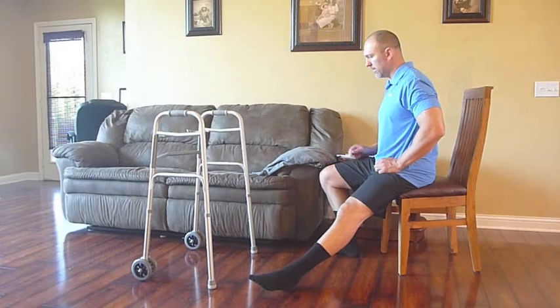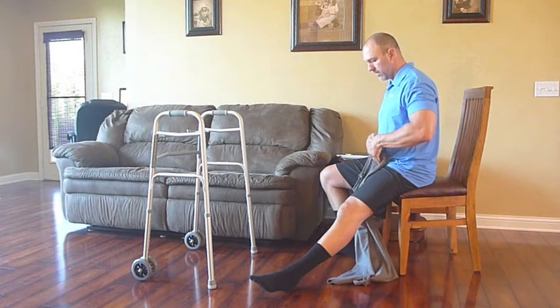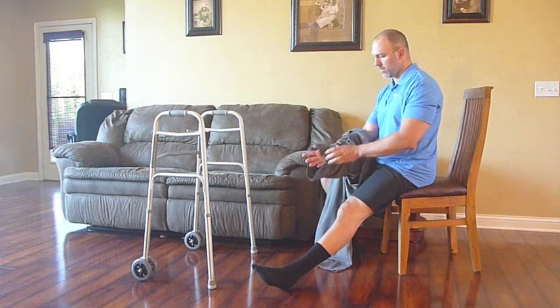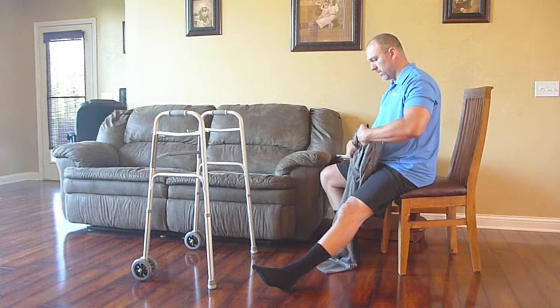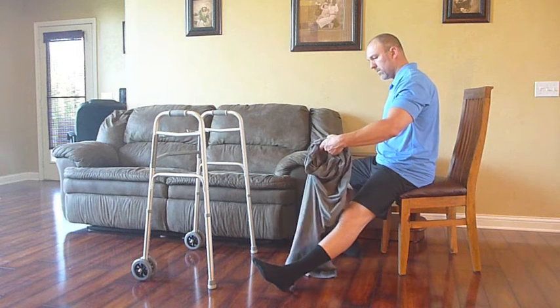Putting your underwear and pants on using a reacher. Since the procedure is the same for both underwear and pants, this video will serve as an example for both. Take your arm and thread it through your pants on the injured leg side, making a nice scrunched hole to grab with the reacher.